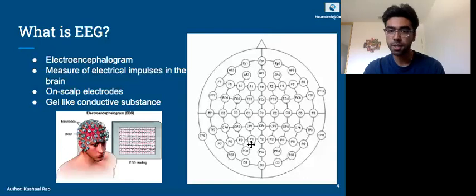And then you have P right here. P refers to the parietal lobe. F refers to the frontal lobe, and you have the T's on the sides, which refer to the temporal lobe. If you remember from module 1, they're the 4 main lobes of the brain, and so these electrodes are organized to fit across main areas of the brain. And obviously, if you see a combination of letters, like CP, that's central parietal, so it's between the central and the parietal areas of the brain. It's fairly intuitive if you know a little bit about the brain structure.